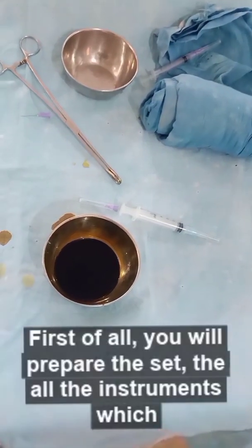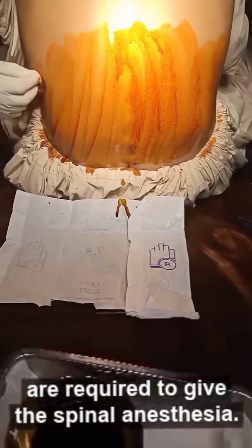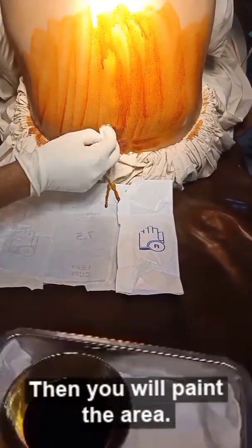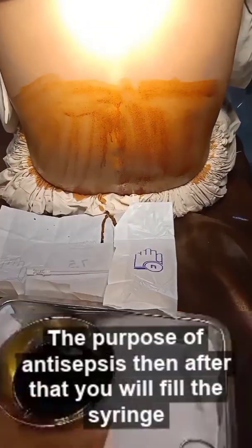First of all, you will prepare the set — all the instruments which are required to give the spinal anesthesia. Then you will paint the area, more area as compared to the required area, for the purpose of antisepsis.